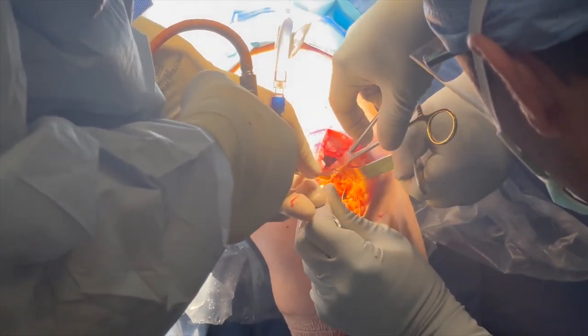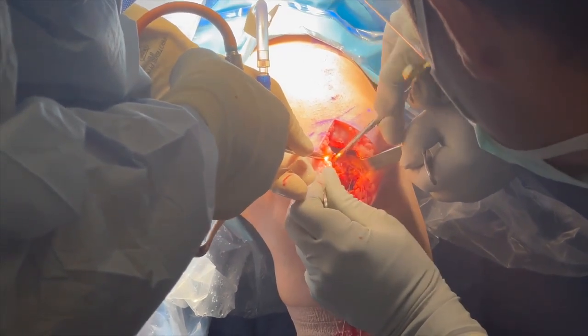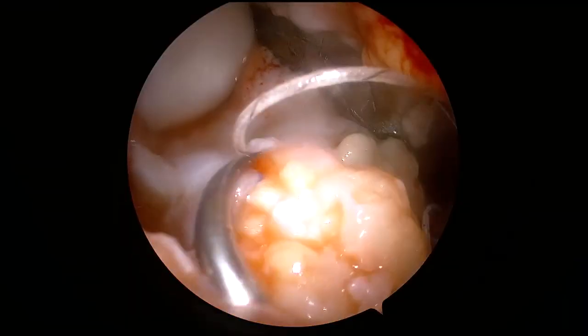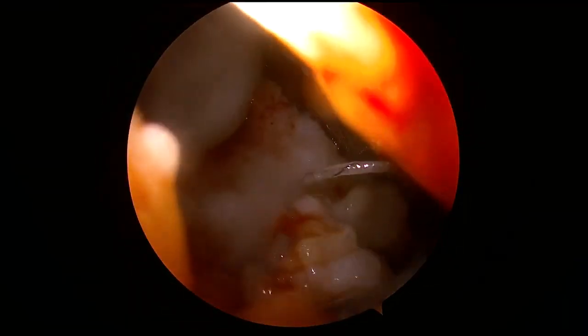While continuing to use the arthroscope for visualization, a free needle is used to pass the suture limbs from the Q-fix anchors into the substance of the medial meniscus. In this arthroscopic view, a suture can be seen being passed through the substance of the meniscus.